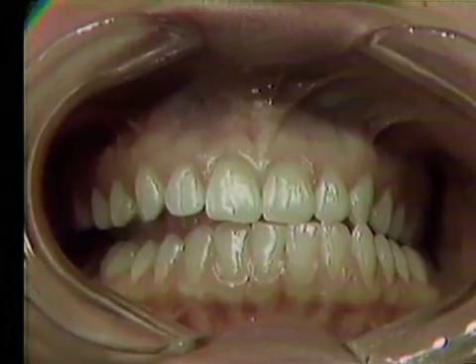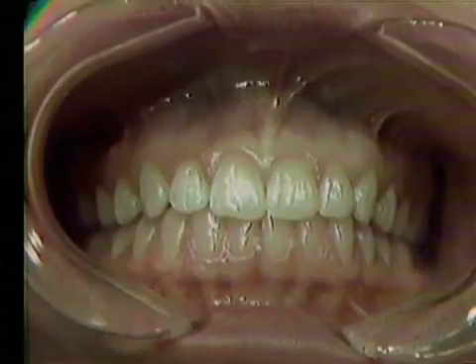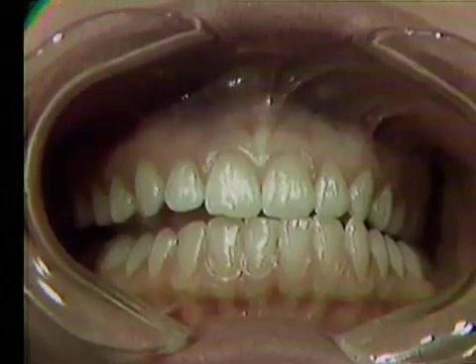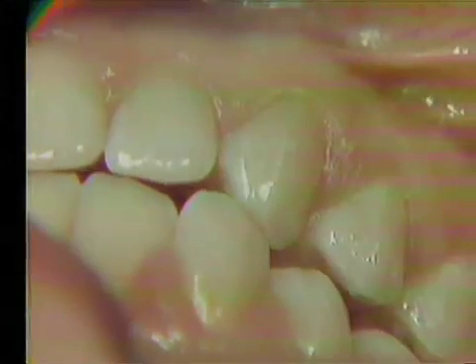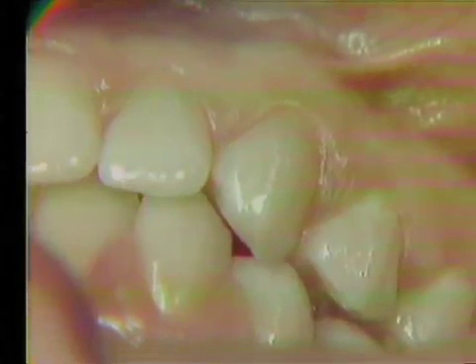The working contacts are examined on the left side. The cuspids are contacting during most of the movement. Note the occluding inclines and compare with the wear facets examined earlier. In a wide working excursion, the incisors contact. Working contacts that shift from the cuspids to the incisors are usually in harmony with smooth mandibular movements. Anterior guidance is a desirable concept of occlusion in working excursions. The cuspids do not occlude in centric occlusion; individual tooth position and working wear facets are responsible for the lack of centric contacts. Anterior tongue position during swallowing prevents hypereruption of the teeth and therefore maintains the disocclusion in centric.